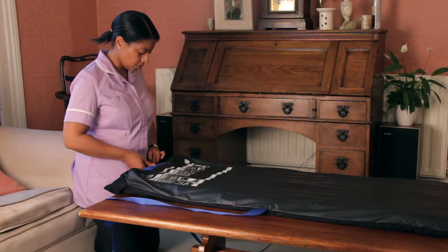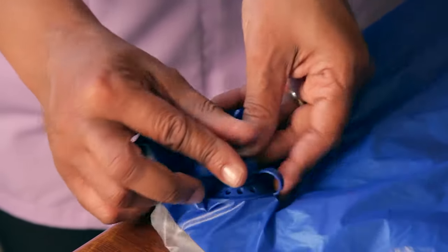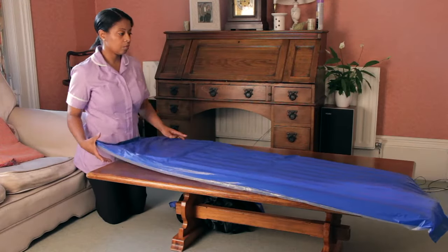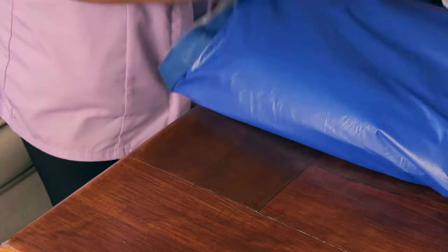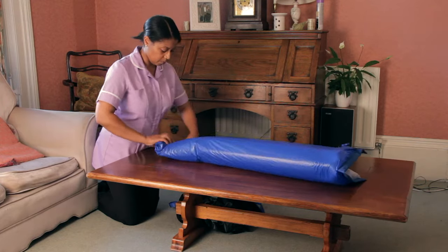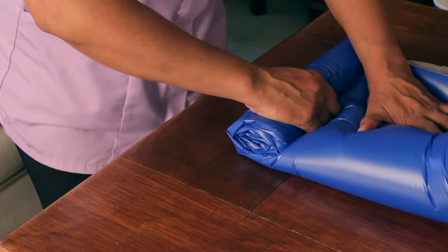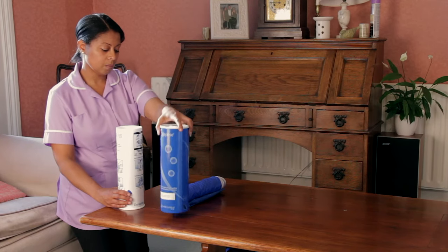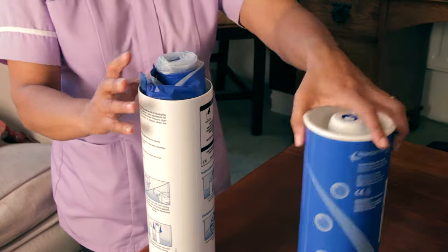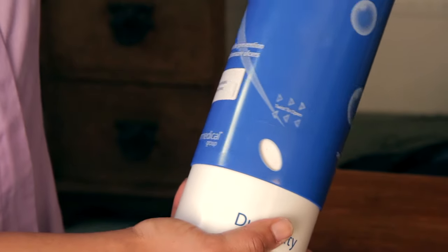To deflate the contour, first insert the open end of the valve cap into the device valve. Air can now escape. Fold in half and roll it up, making sure to start at the end furthest away from the valve. Air will be released as you roll up the product. Insert the device into the pump and refit the two tubes together and rotate until the two tubes click closed.